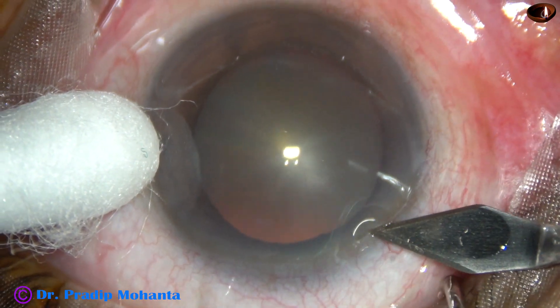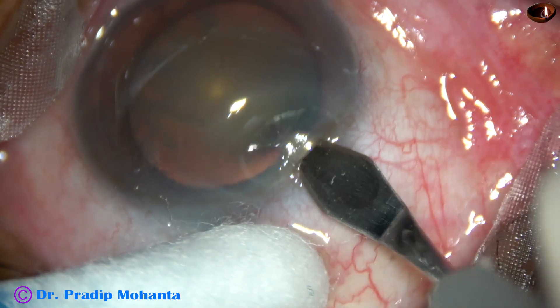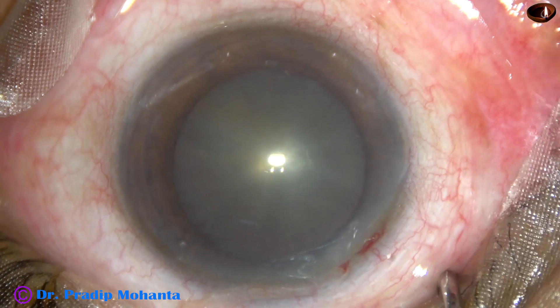This is the main incision with a 2.8 mm steel keratome. A cotton-tipped Johnson bud is used to support the eyeball. The patient is under topical anesthesia.